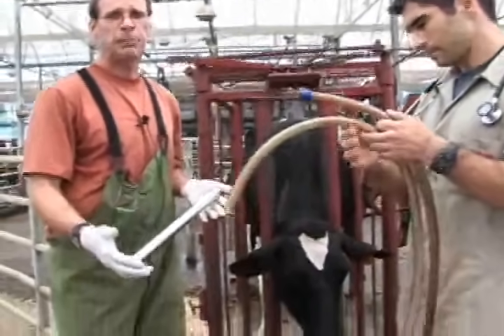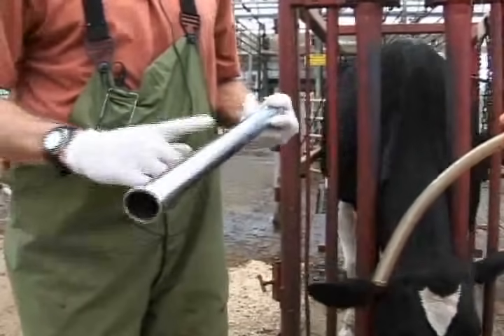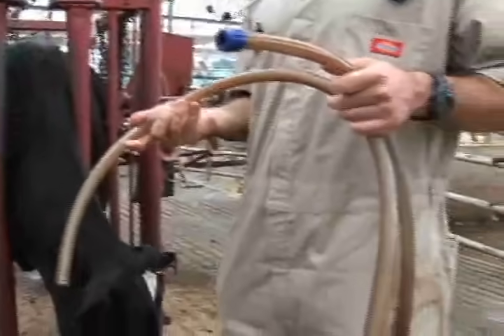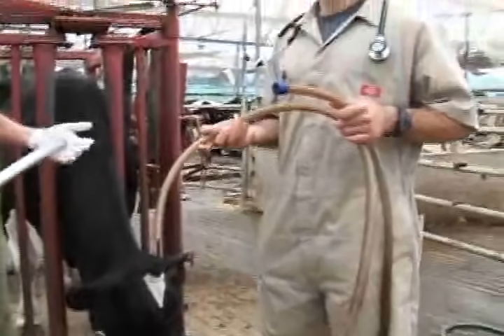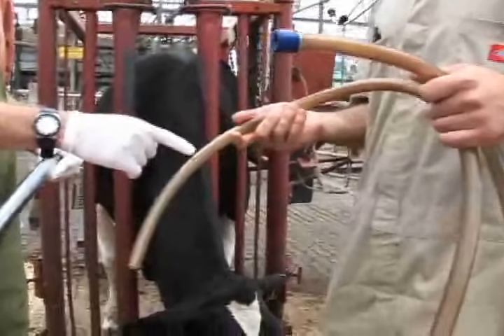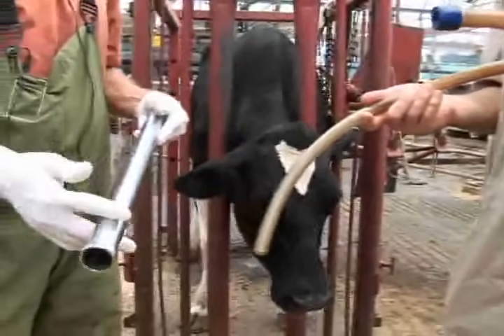It involves a Frick speculum. This Frick speculum is placed into the mouth and the cow is allowed to chew on it, which will protect our tube — the next component. This is a nasogastric tube, but for our cattle it's actually passed orally, so it becomes an oral gastric tube. We don't want her chewing and creating holes in our tube, which can be quite expensive, so we protect it with a Frick speculum.